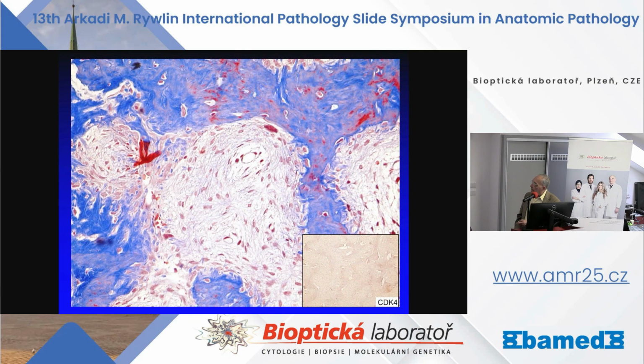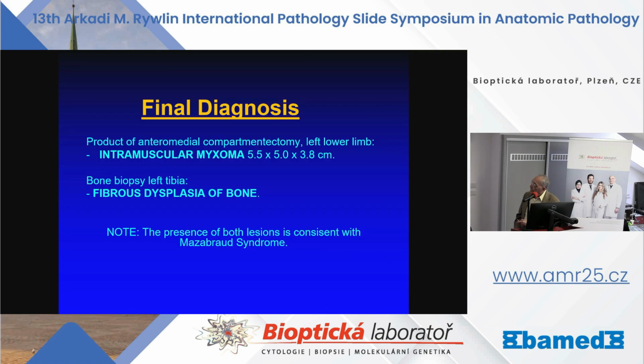And with the Masson stain it was even more visible, the contrast. So the final diagnosis, reconstructing the case, was an intramuscular myxoma mixed with fibrous dysplasia of bone. So the presence of both lesions is consistent with Mazabraud syndrome.